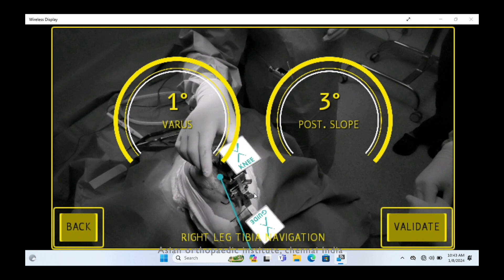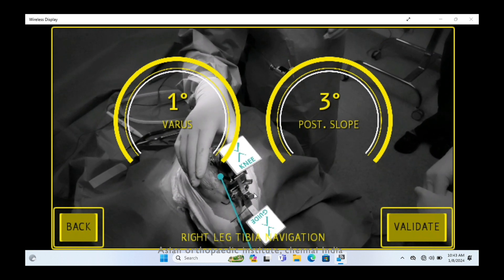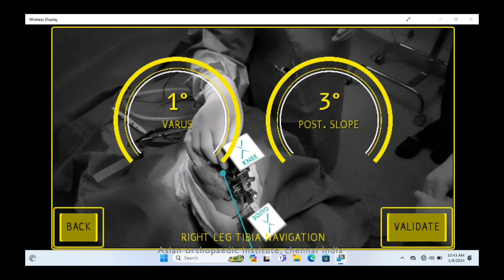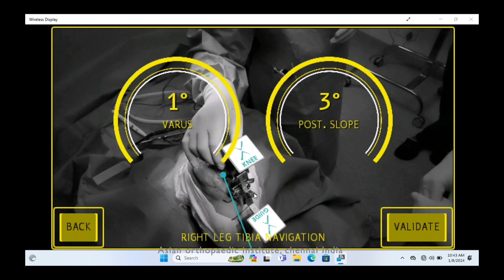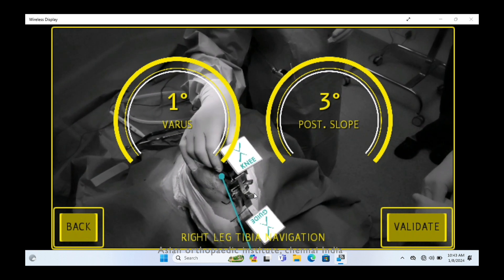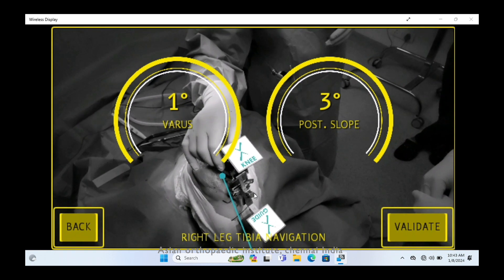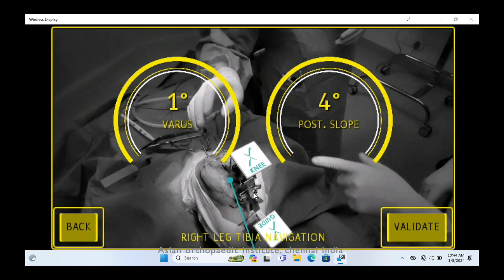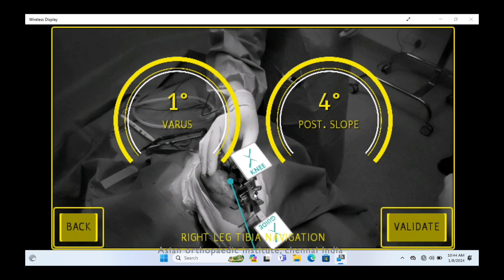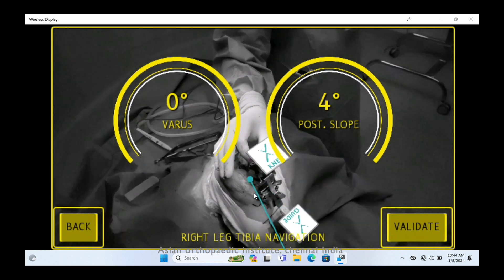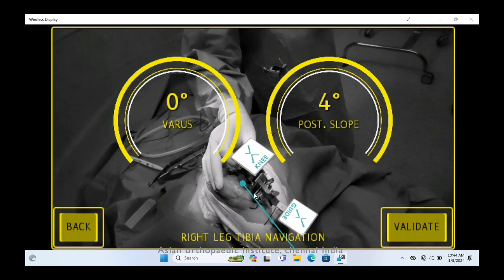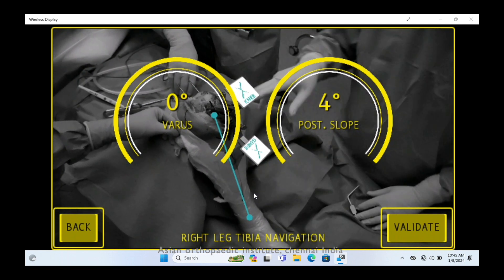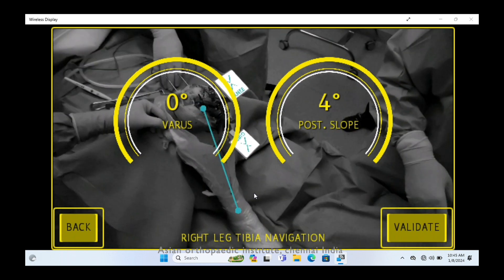Make sure you focus both eyes on the knee tracker as well as the guide. Once you achieve the target, fix the stabilizer guide with stabilizing pins — four pins — then lock the desired position and validate it.